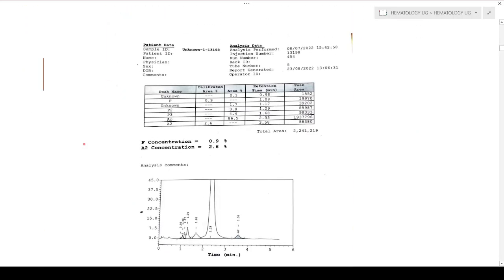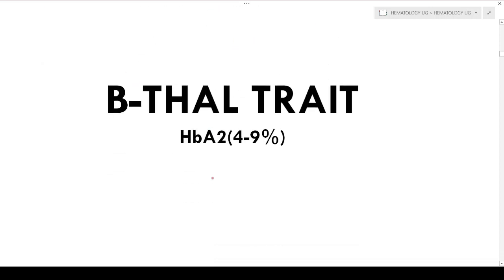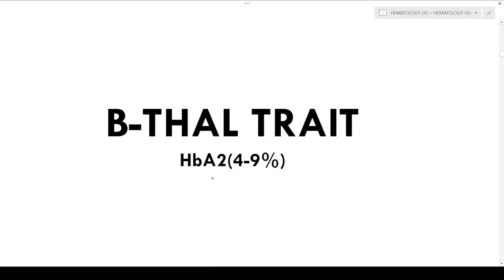This is a normal sample from our college. Hemoglobin F is less than 1% — approximately 0.9%. The A2 concentration is less than 3.5%; here it is 2.6%. We can see the A2 and the A0 here. This is the basic normal sample.